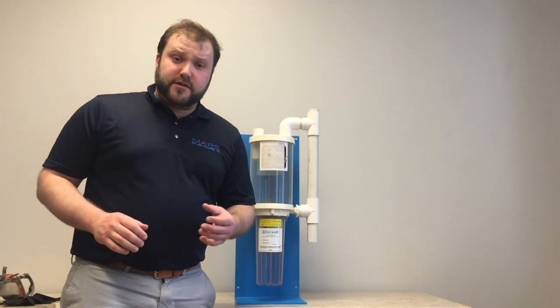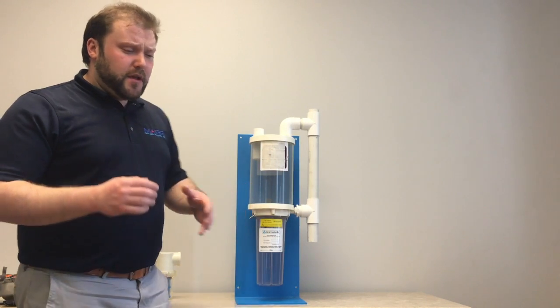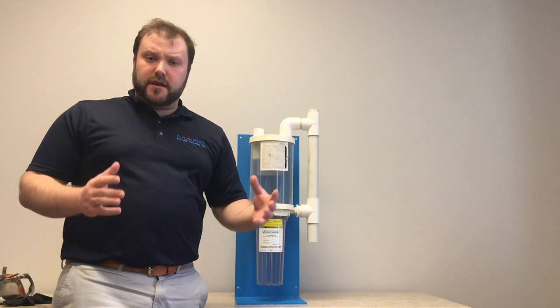Today's preventative maintenance course is talking about the SolmeteX Hg5 amalgam separators. What I'm going to do is inform you on the manufacturer's required maintenance.